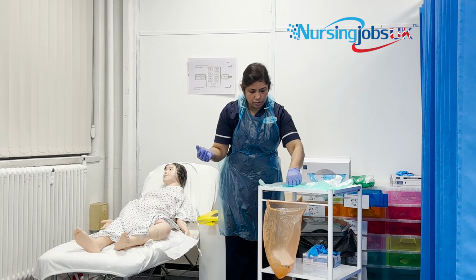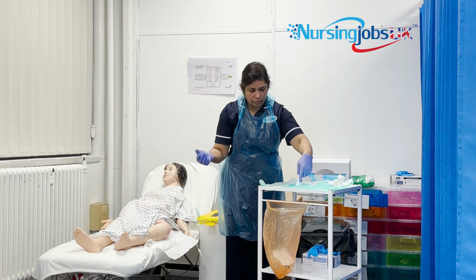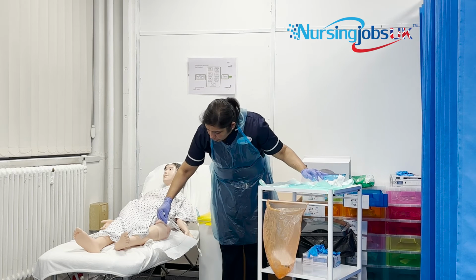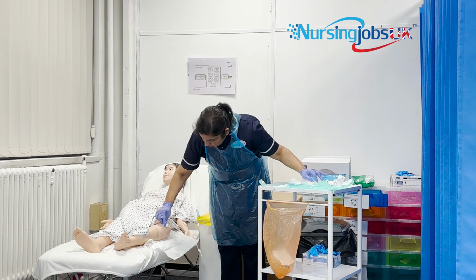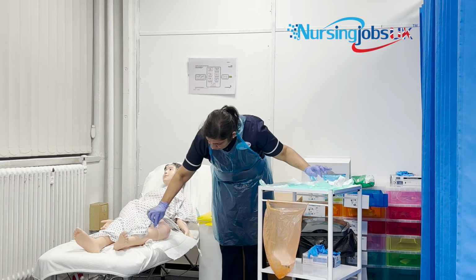So now we need to take one gauze piece. Squeeze it and drop it like that. Now you need to clean from the less contaminated area to more contaminated area.